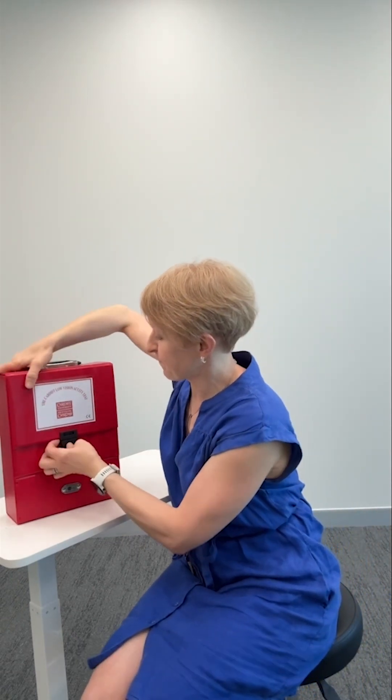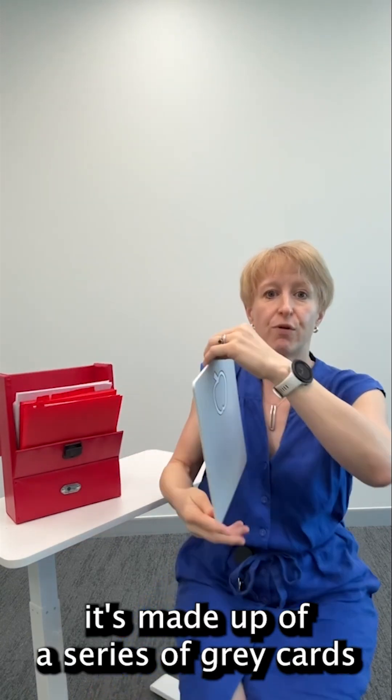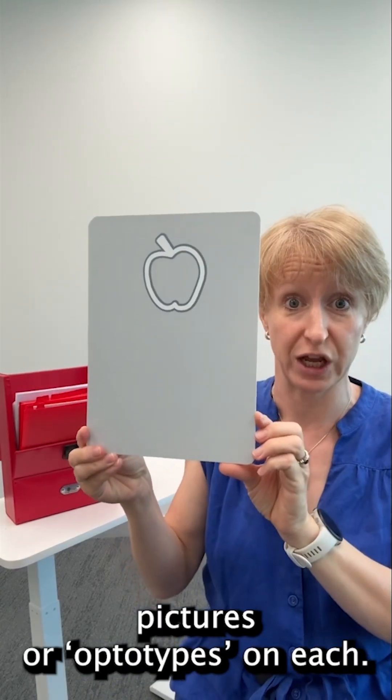So here it is — I have a red box and when I open it, it's made up of a series of grey cards with different pictures or optotypes on each.